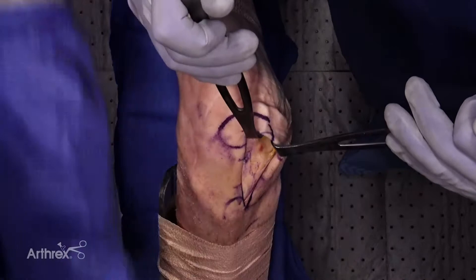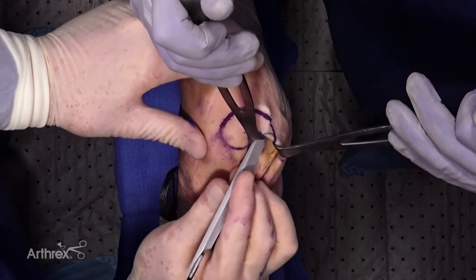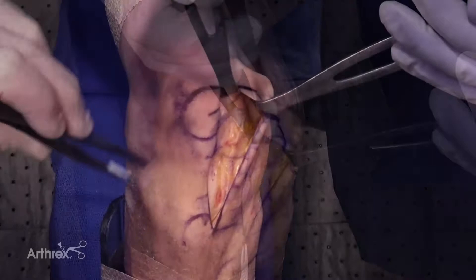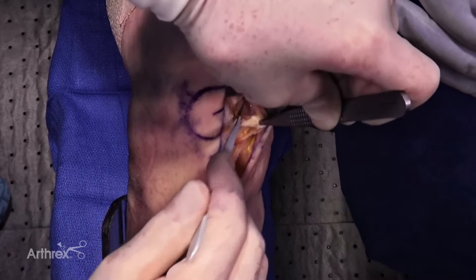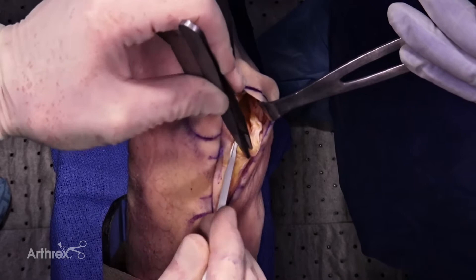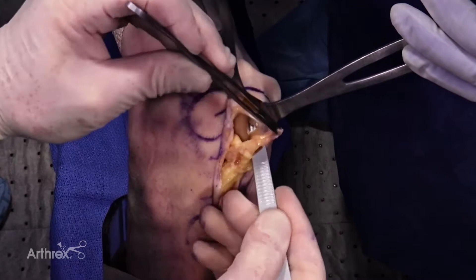I'll have my assistant come up and over, and the vastus medialis — the medial quadricep — is right here. What you can do is just take a snip at a 45-degree angle up into the VMO and then down along the patella tendon, right beside the patella tendon. You can see muscle fibers in there — that's the vastus medialis muscle belly, and that'll heal really, really well. What that does is create a mobile patella so that I can end up having really good visualization.